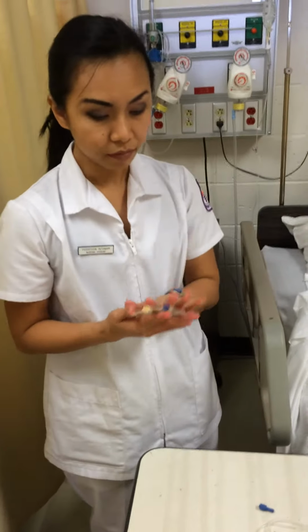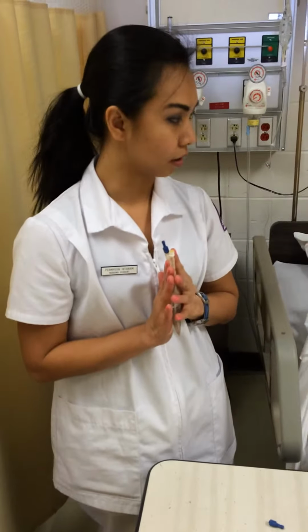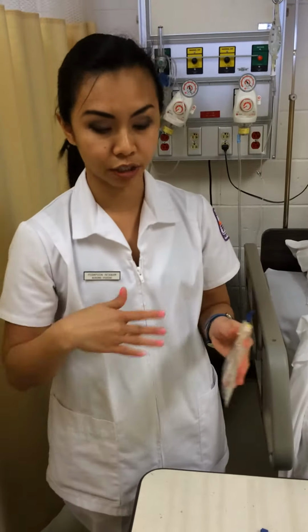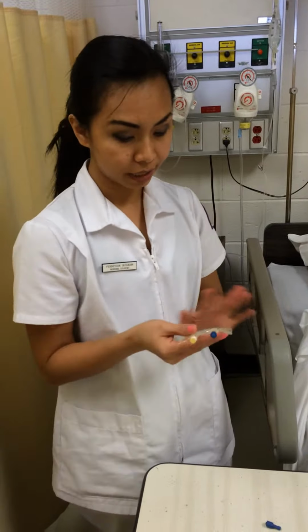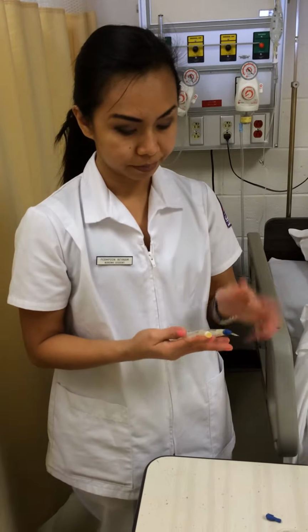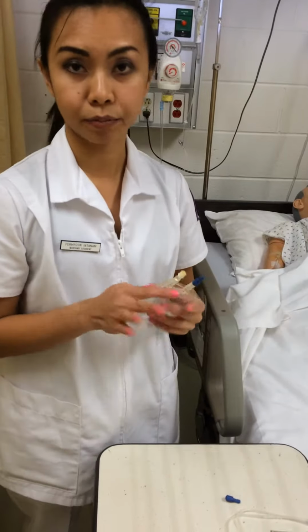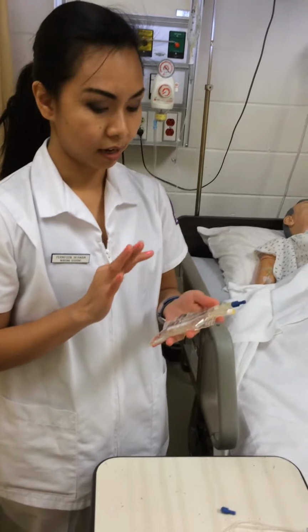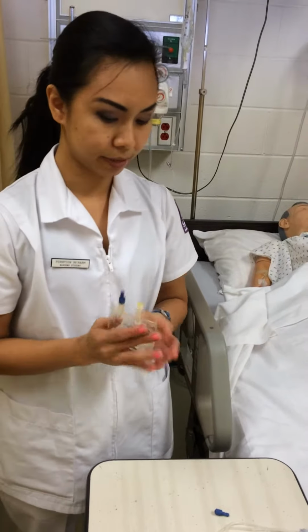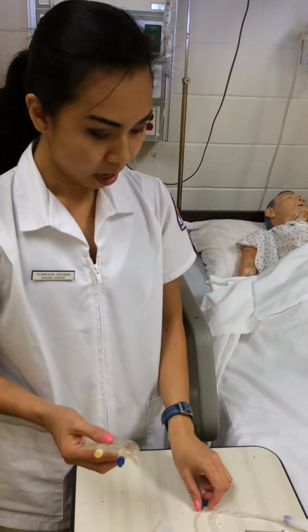So I check the medicine with the patient's chart and the patient's order, compare, and I check the label 3 times, compare 3 times, and then I timestamp my name, the medication, and the date and time.